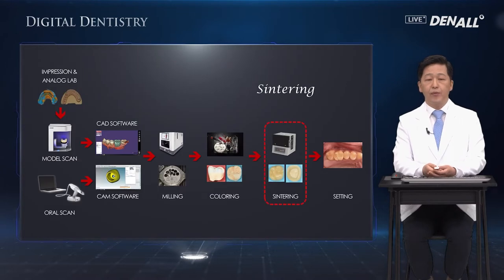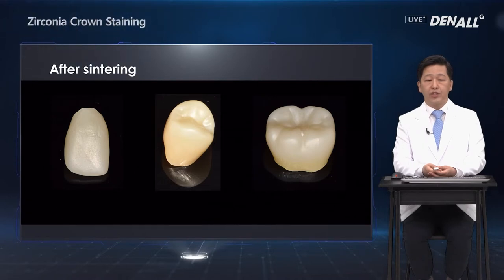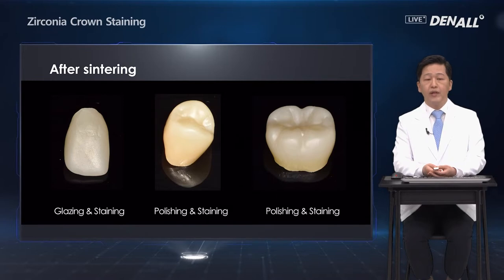After sintering, the surface of the crown needs to be smoothened. For anterior teeth, we do glazing and staining on the surface. For premolars and molars, polishing and staining are done on the surface.